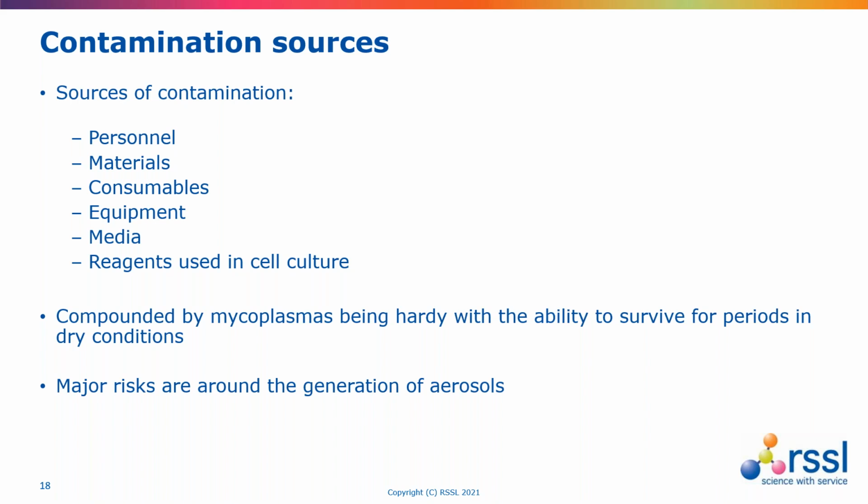In terms of how contamination arises, and considering the sources of contamination, these are quite varied and include people, materials and consumables, equipment, poor quality culture media itself, and the reagents used for cell culture. That's because they are ubiquitous and are found in many, many niches. An example of how easy they are to spread could be the ease of droplet generation during the handling of cell cultures, or even the fact that some commercial cell cultures are actually received contaminated in the first place.